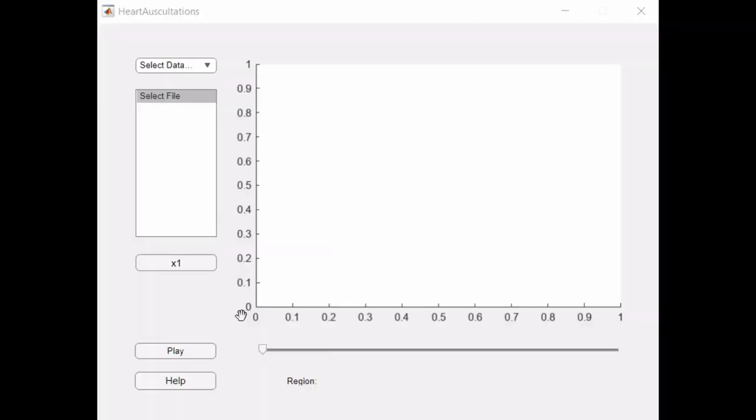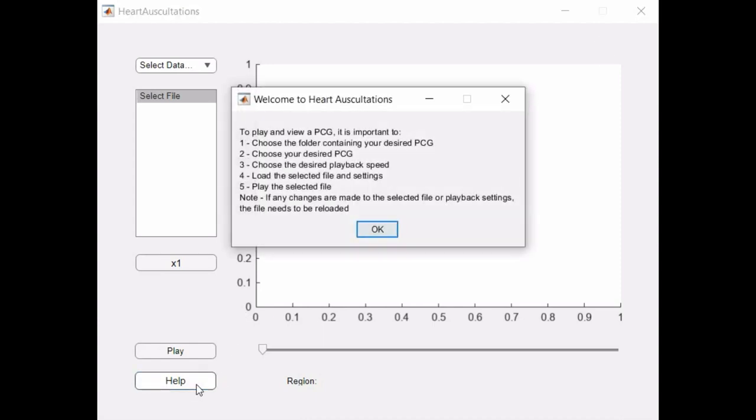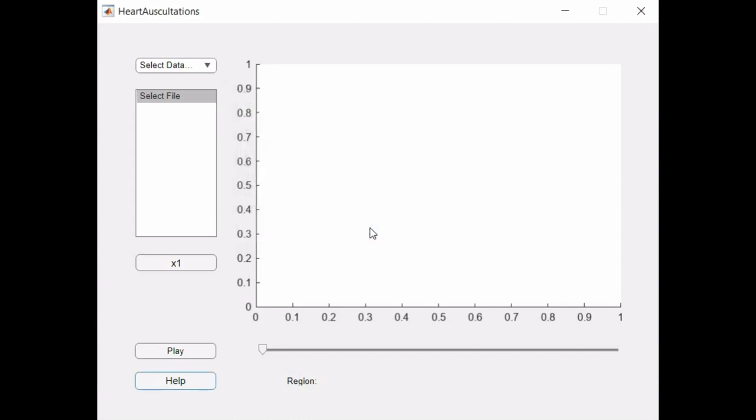The visual application. A goal for the heart murmur diagnosis program was to create an educational tool to train the next generation of doctors. To this end, a standalone computer application was created. The application outputs an interactive graph of a phonocardiogram from a database containing normal, aortic stenosis and mitral stenosis files. The visual application includes a help button which explains the working of the application. The user is then allowed to choose the type of phonocardiogram and the file number that they wish to display.